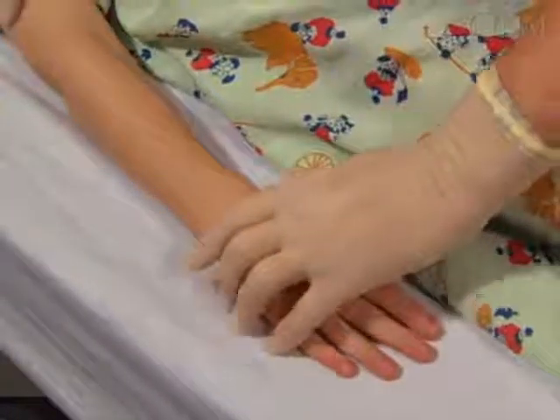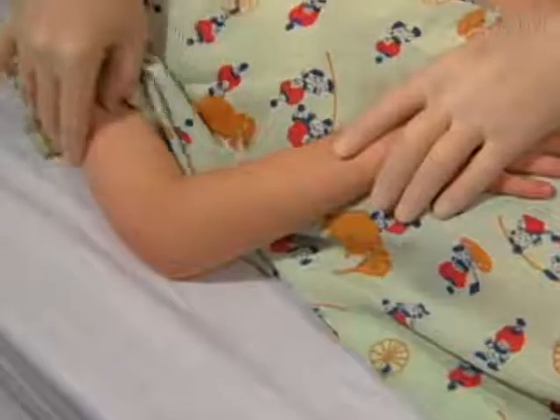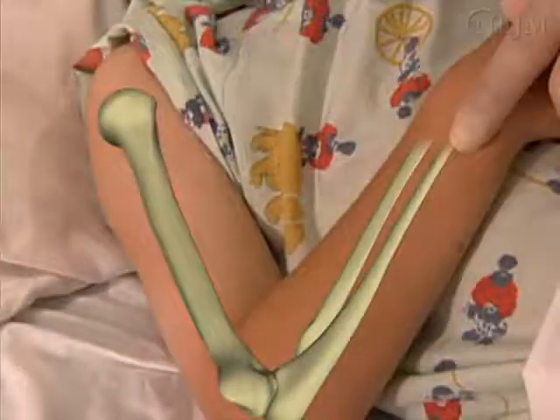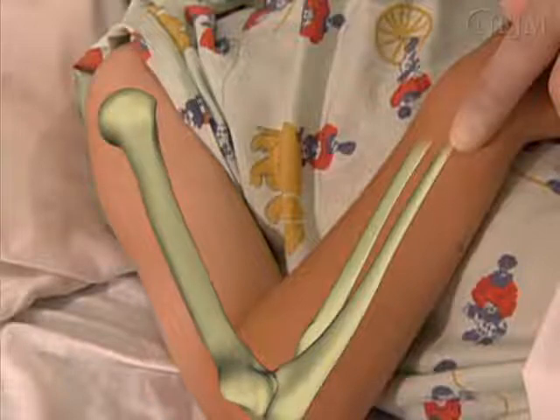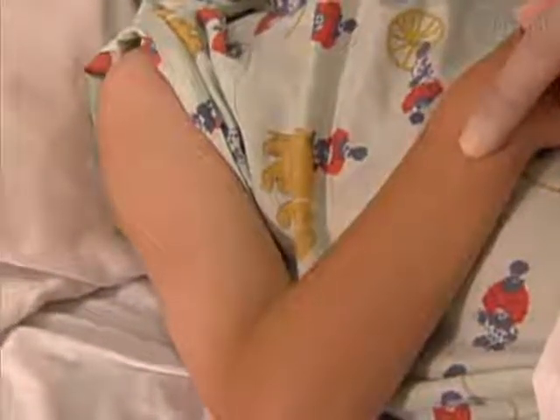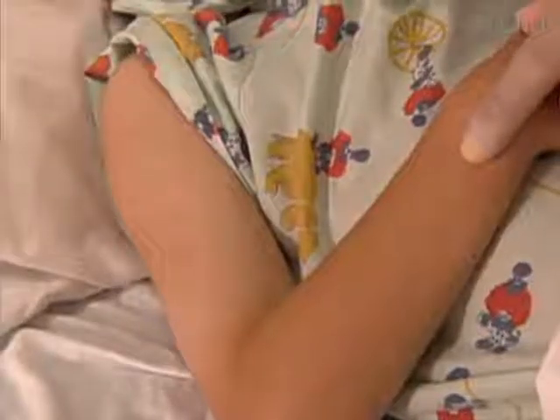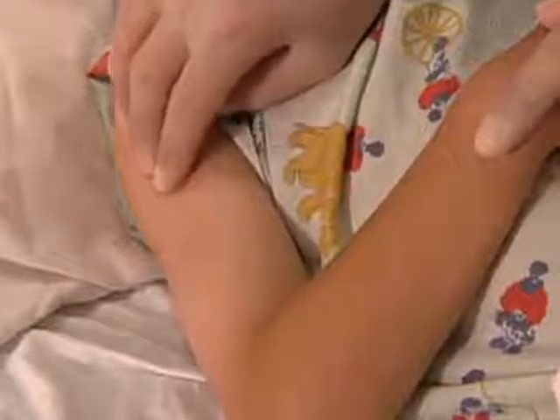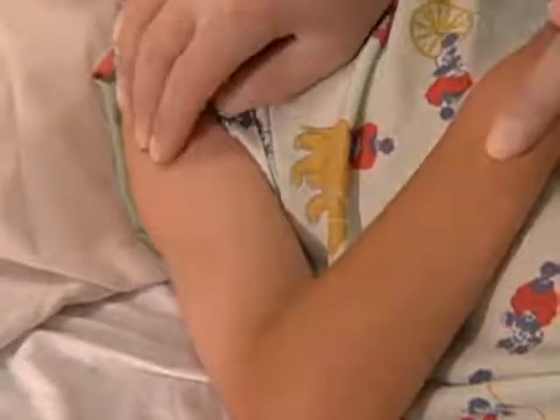When tibial sites are not available, or when previous attempts have been unsuccessful, the proximal humerus can be used for intraosseous cannulation. With the patient in the supine position, rest the ipsilateral elbow alongside the torso. Because the overlying deltoid muscle can make identification of landmarks challenging, begin by palpating the mid-portion of the humerus in the upper arm. Follow the bone proximally until the greater tubercle is appreciated.